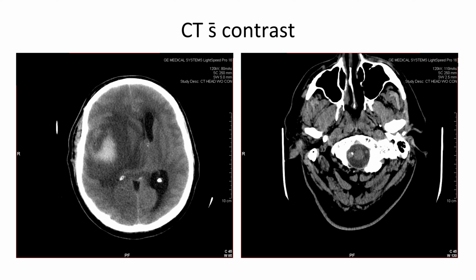And in the vertebral artery on the right, you can see a large white dot in the wall of the vessel. That is a vertebral dissection. And these frequently happen anytime the head gets impacted or twisted. They can cause strokes and things in the brainstem. So these are important to look for as well.